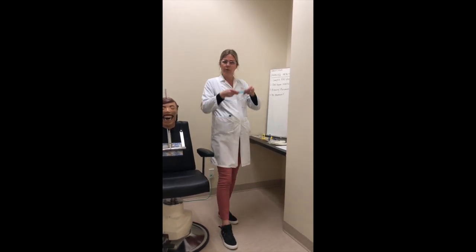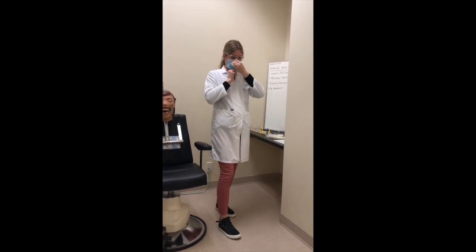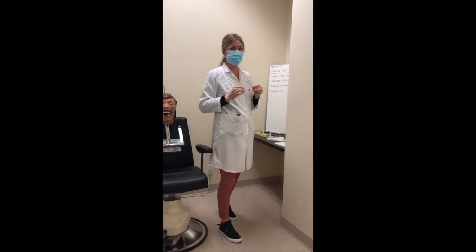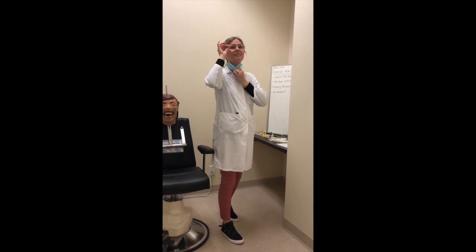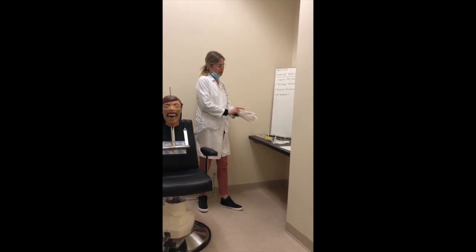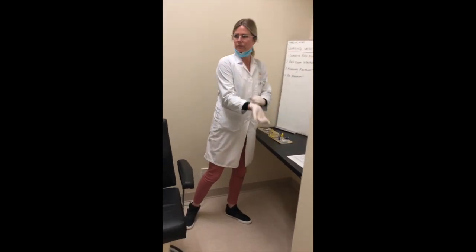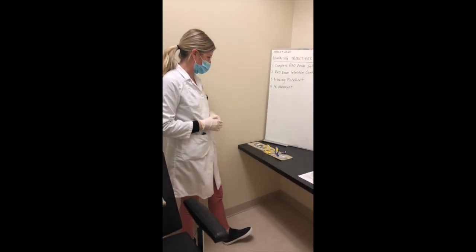Starting with your personal protective equipment. Always want to wear a mask when wiping down the room. Making sure that it is tight up against your nose, leaving an area where you can breathe underneath. Safety glasses. For video purposes I'm going to remove my mask so that you can see what I'm saying. So infection control — I'm going to start off with the gloves. My mask would be worn consistently throughout.